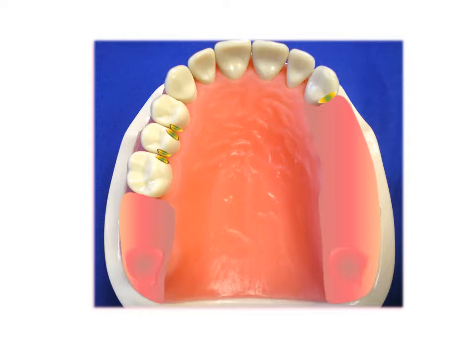Definitely a short guide plane on the distal of number 11, being careful not to over-prepare the tooth. Then, long guide planes on the lingual axial wall of the bicuspids and molars, as shown in the diagram. Next, we want to place rest seats. We'll consider potential fulcrum lines and clasp types here.